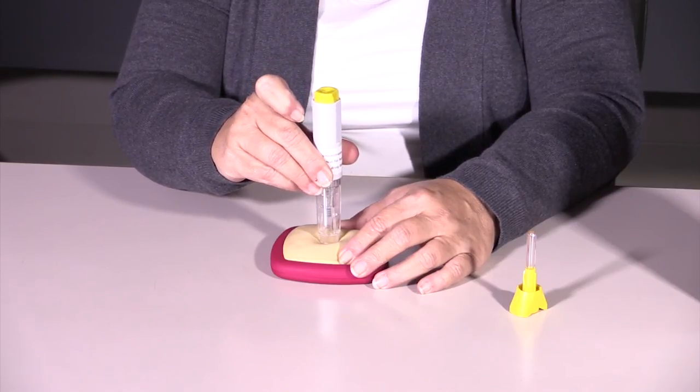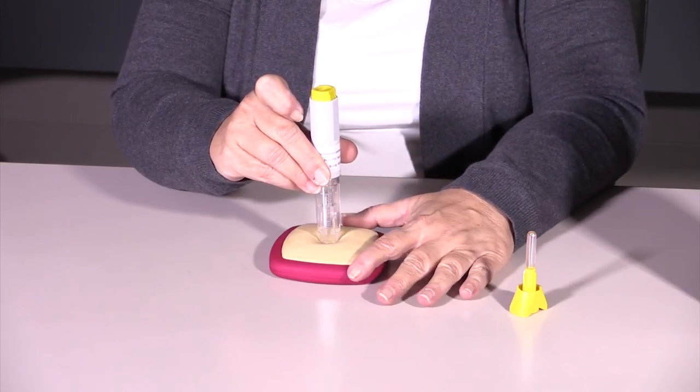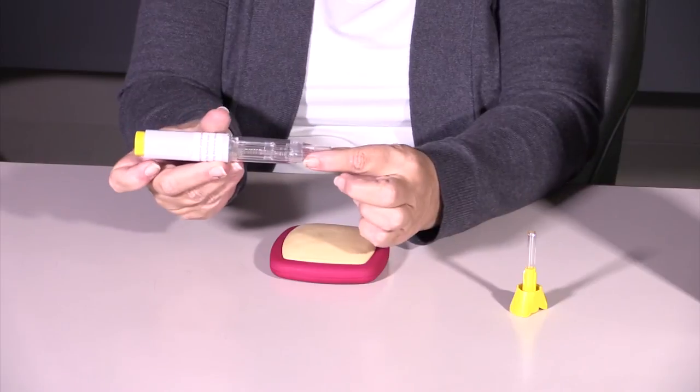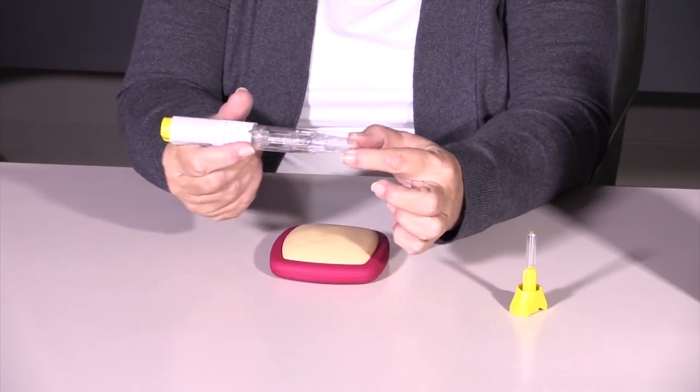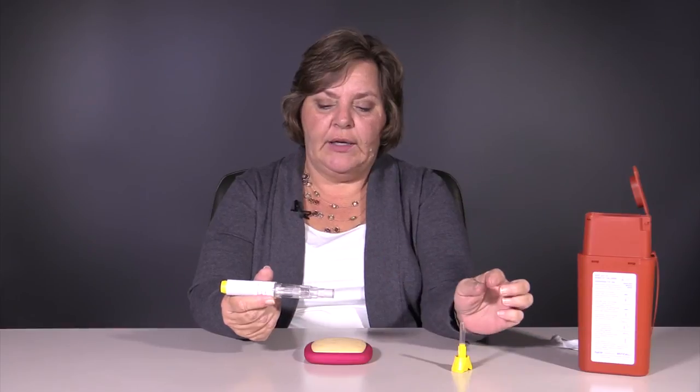It makes a fairly loud click. You'll see that the medication has injected. You pull it away, and this guard you'll see has come out a little farther than when we first started. Once you're finished, you're going to deposit this into your sharps container, and you're finished. Most of the time this will not bleed, but if it does, you can just hold a little tissue on there. Occasionally you may need a Band-Aid. But that's all there is to injecting Resuvo.